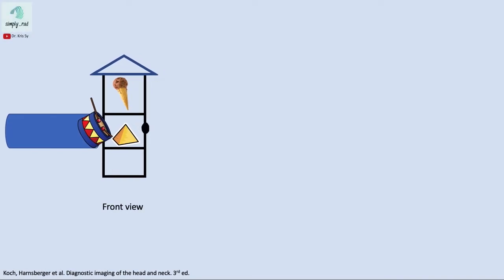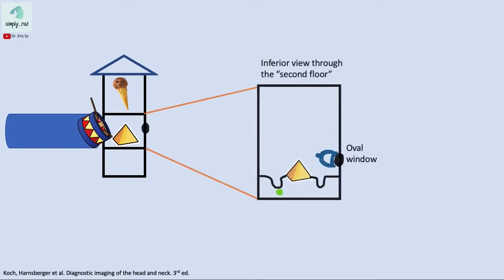Now let's look at the residents of the second floor. Looking at the second floor from below, we see a pyramid called the pyramidal eminence. It has depressions on both sides. On this cut, in just a few adjacent slices, we can also see the stapes. We'll discuss the important relationship of the stapes and the pyramidal eminence shortly.